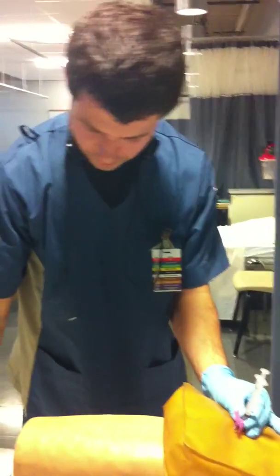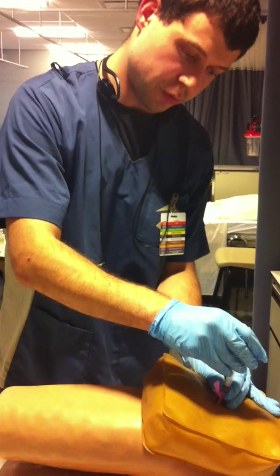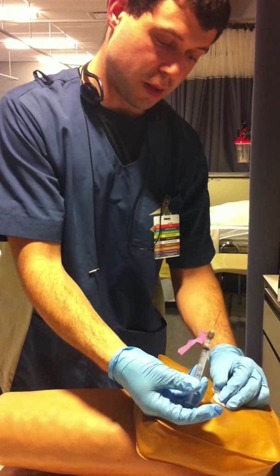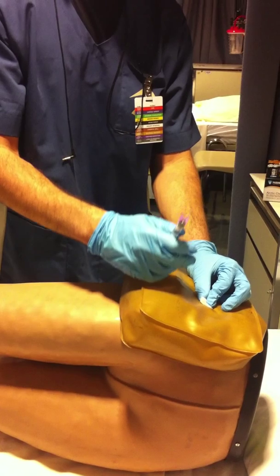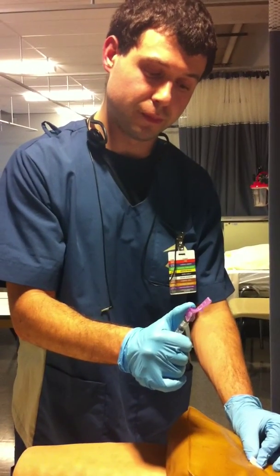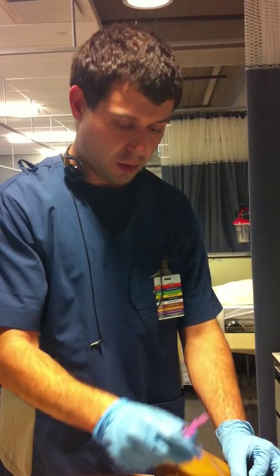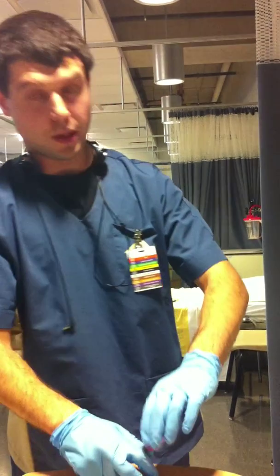Get my gauze ready. Now I'm going to withdraw this after 10 seconds. And this will facilitate absorption. By putting a gauze pad here, the gauze pad will facilitate absorption. I'm going to cap the needle, and then I can dispose of it at a later time. So, I can take the gauze pad off. Now I'm going to dispose of my needle.